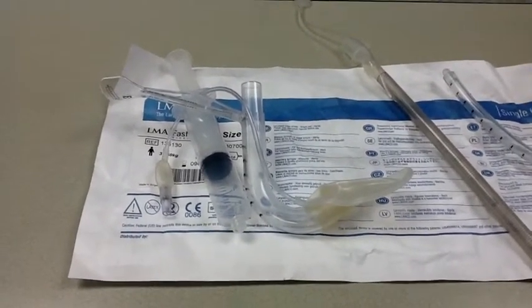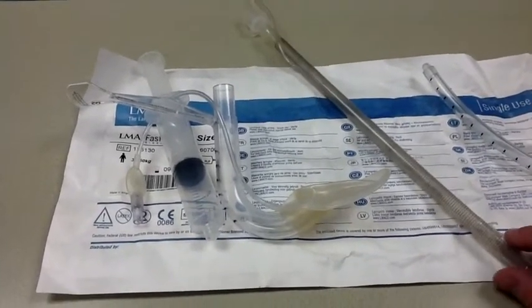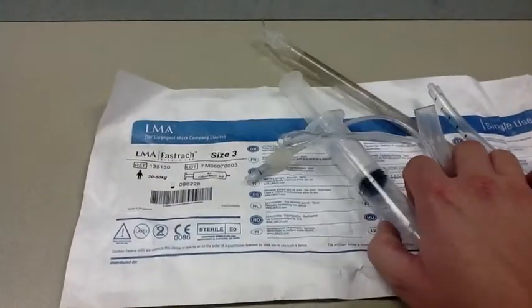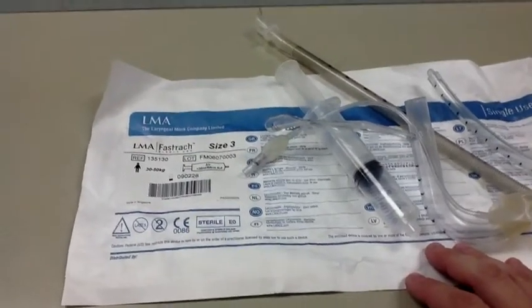Good day, everyone. This is Chris at the Ancient Scholar. Today I'm going to be talking about a somewhat novel way of managing airway in the pre-hospital environment, through the agency of a relatively new device known as the LMA Fast Track, or the Intubating Laryngeal Mask Airway.